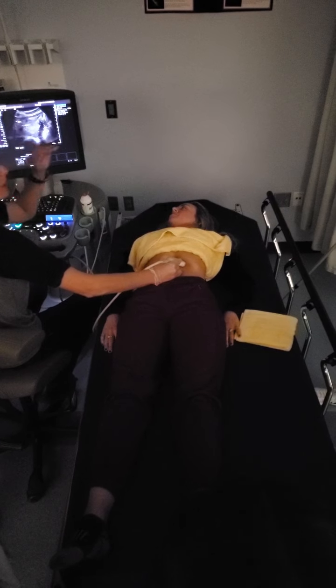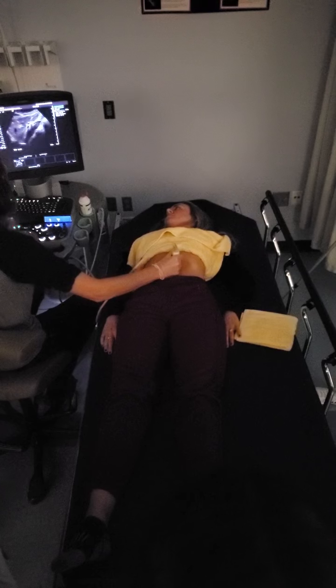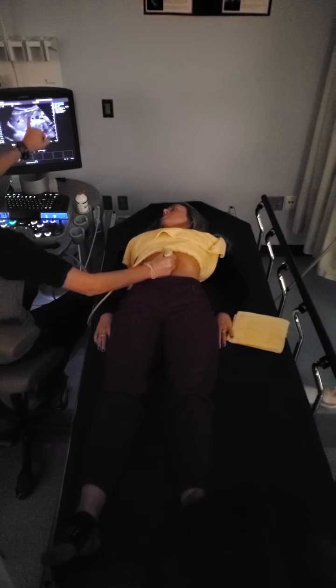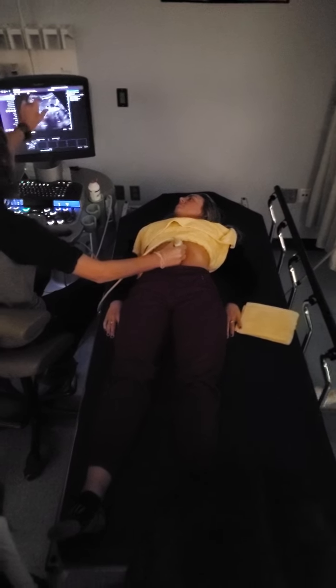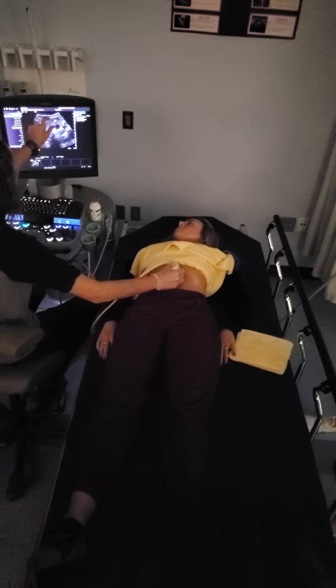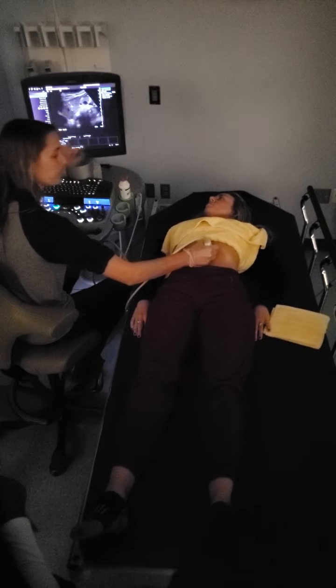There's a significant amount of depth change as we go through. So if we look at sag, see how deep this portion of the left liver lobe is, and as we get more to that inferior portion, it becomes very superficial by the pancreas. So we're going to have a lot of depth when we're doing the dome area, less depth at the mid, and very little at our inferior.